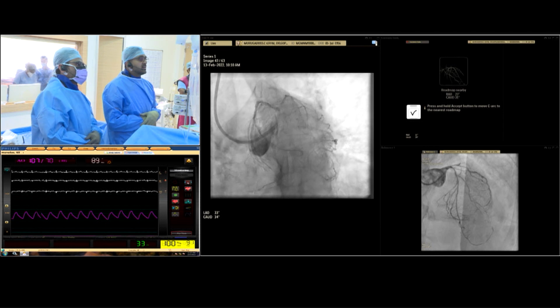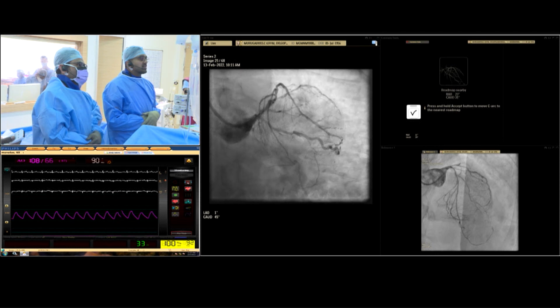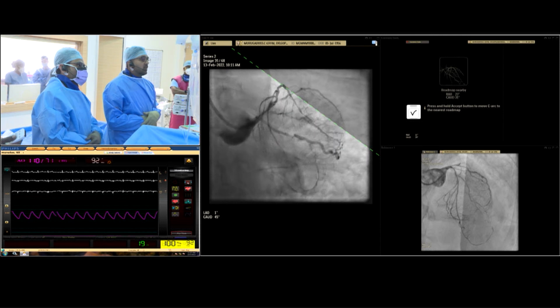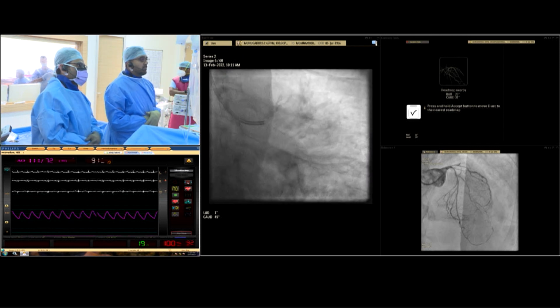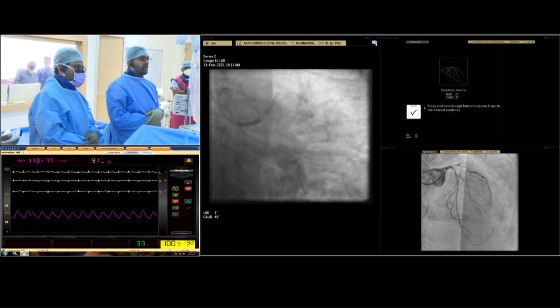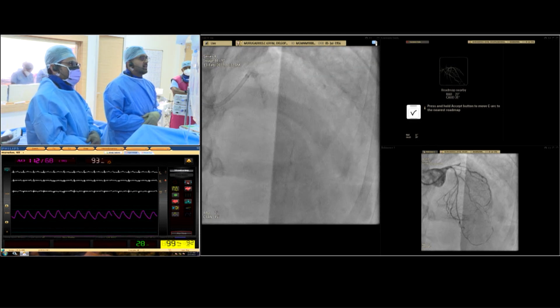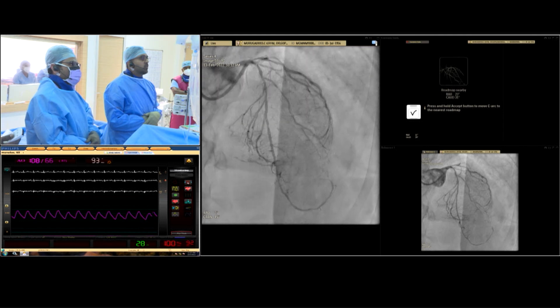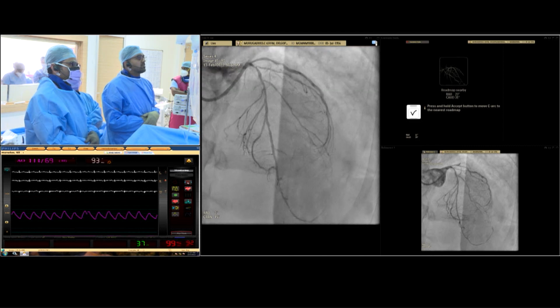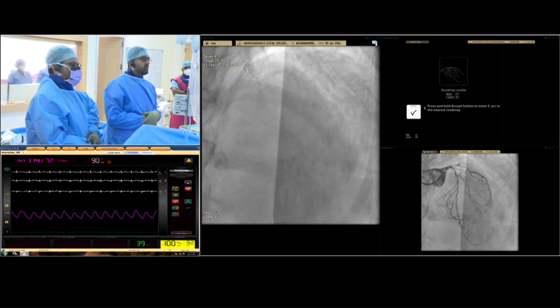And here you can appreciate better the amount of calcification. Next. Again, we couldn't be sure. There is clearly some moderate atheroma in the proximal OM, but the mid OM, I couldn't be sure whether it's a narrowing or a bend. But you can appreciate the proximal calcification from the ostial LAD up to the mid LAD. Next. Next. In this view, one can appreciate the amount of very thick calcium and the very critical narrowing in the proximal LAD there. You can see calcification extending up to the mid vessel. Next.